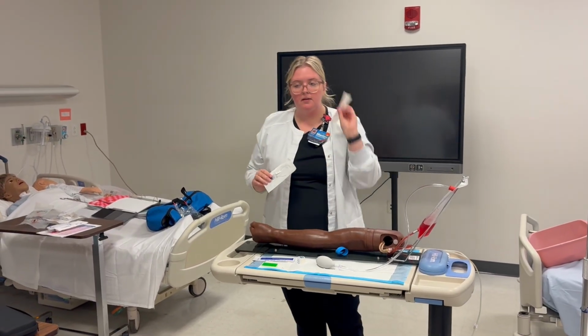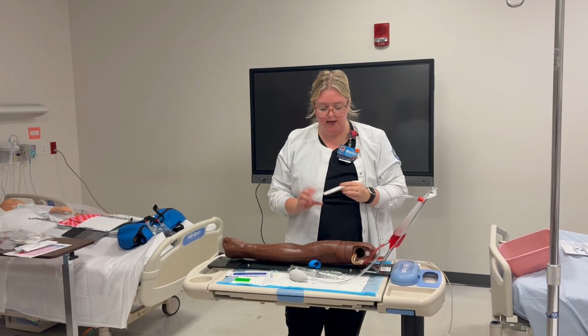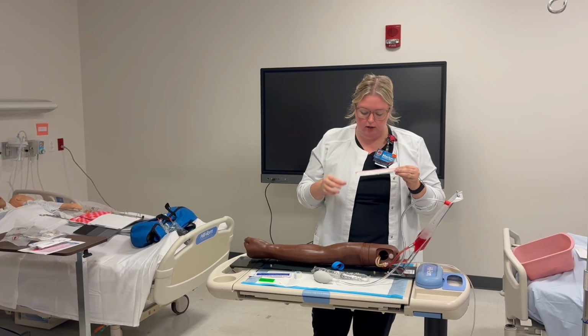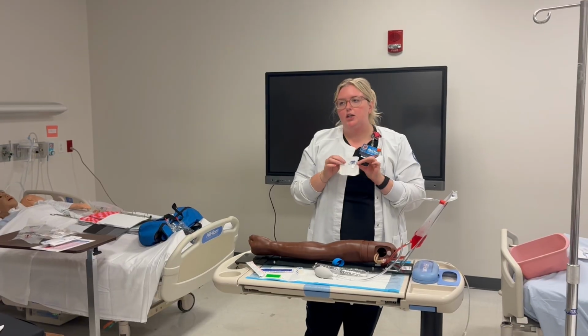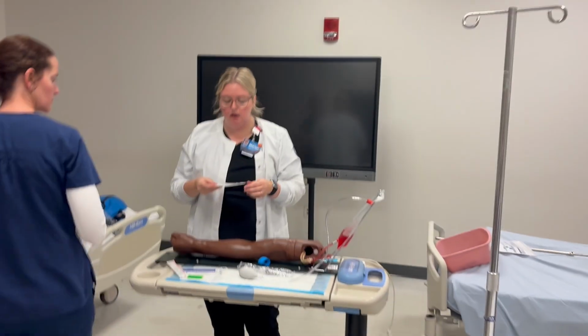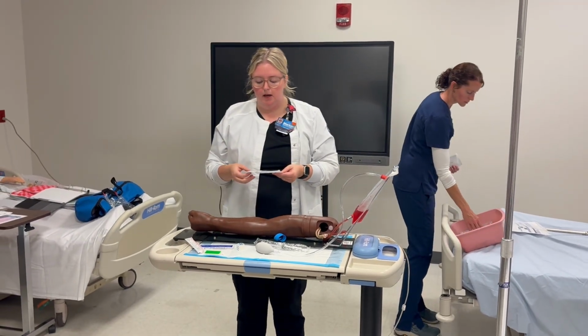Got my IV. It's pink. Do you guys remember what size pink is? 20? 20, yes, but it will say it on the package too. It's important to know what size you're picking because it helps for documentation later. I got my 20 gauge IV. This is called a J-loop, an extension. We typically refer to it as a J-loop. This is what you will use to hook your primary tubing up to.